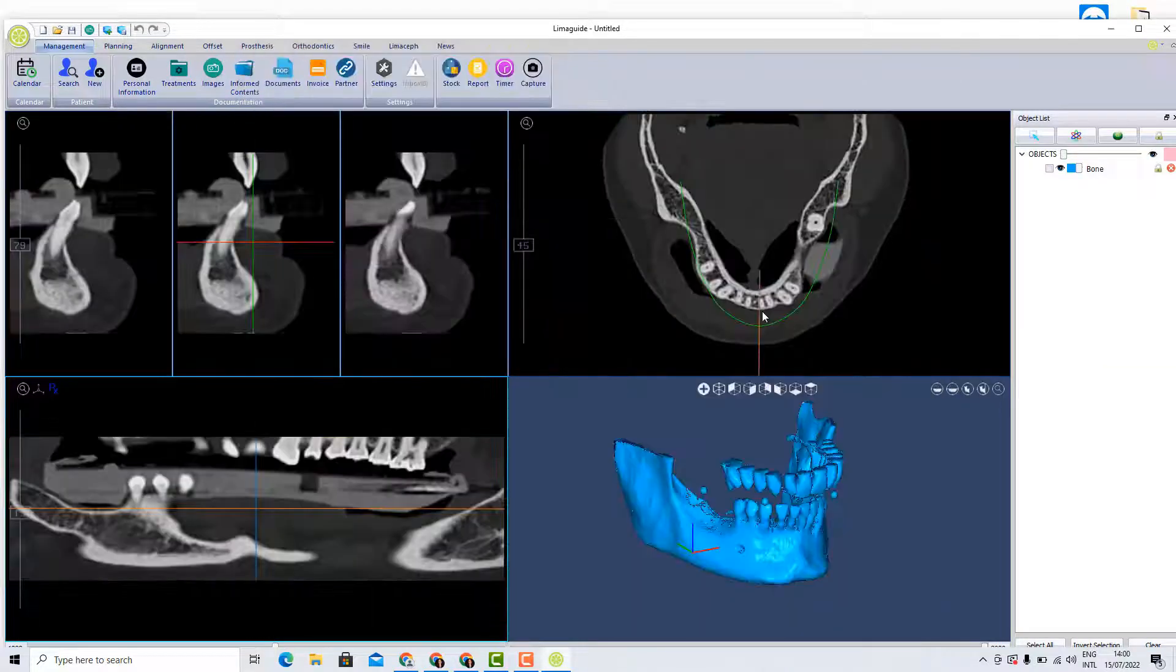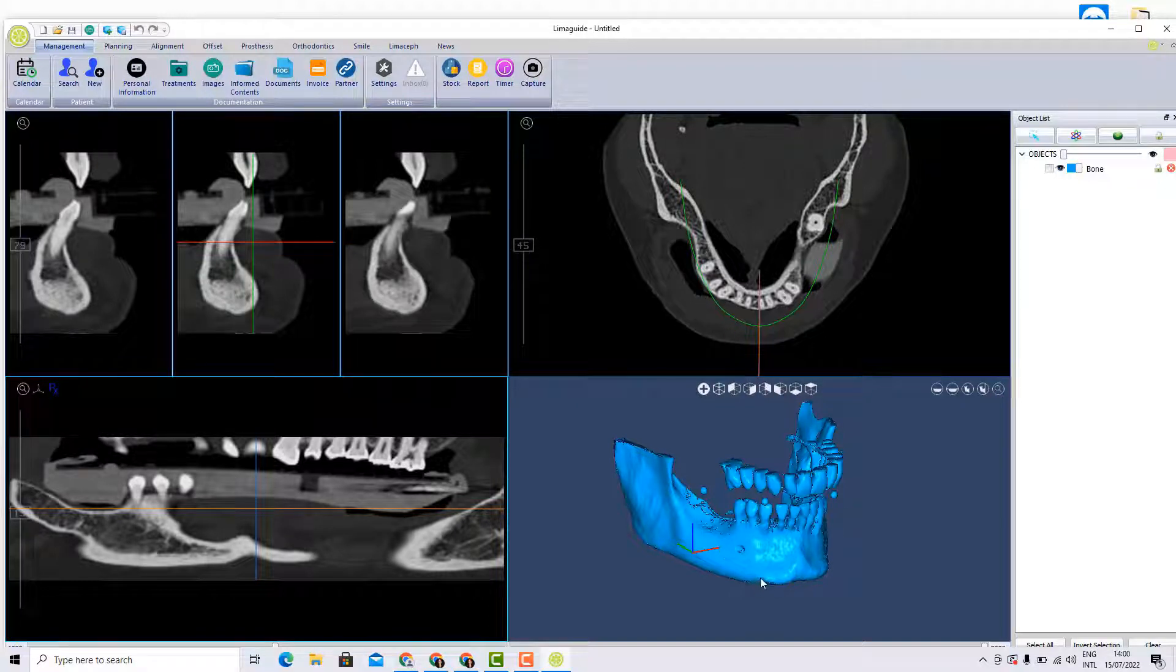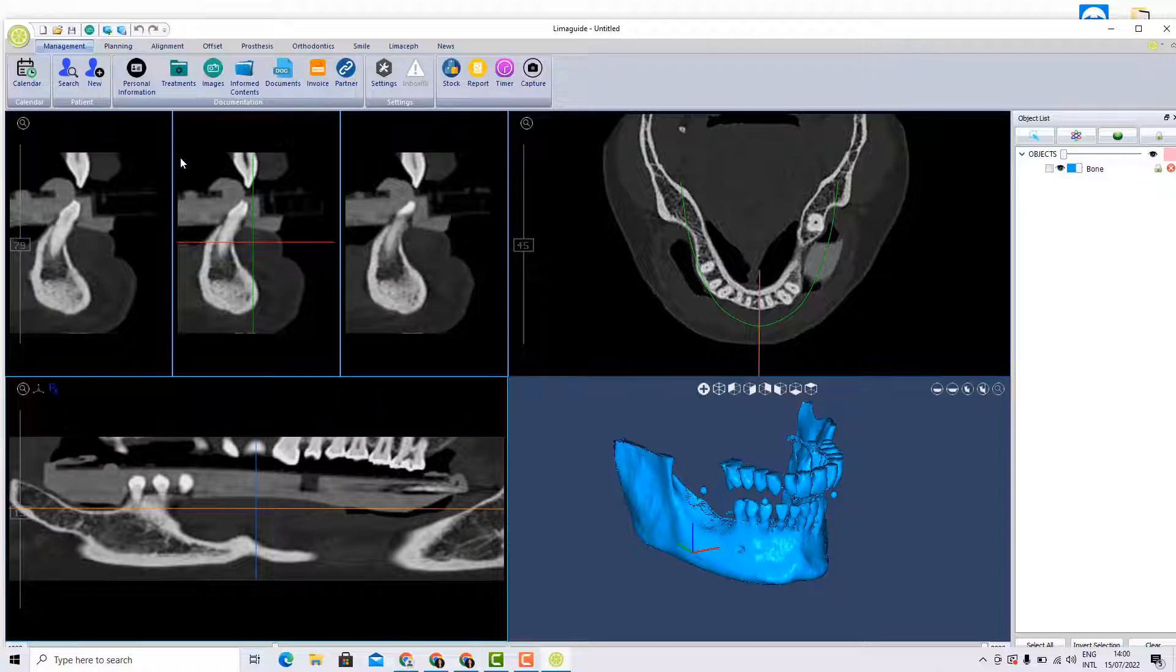So here we will have four different views. For example, one of them is the 3D reconstruction of the jaw, and usually this view depends on the DICOM quality. So let's see a little bit what are the tools that Lima guide has.